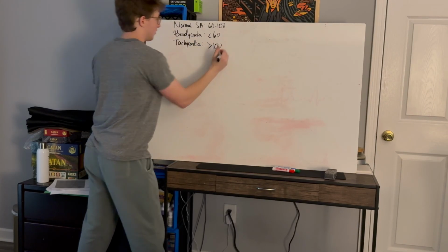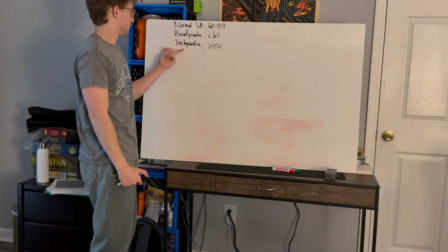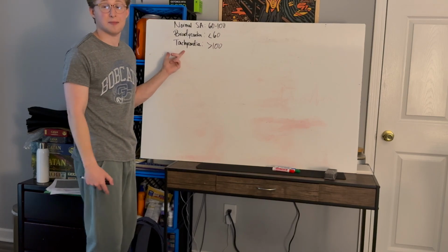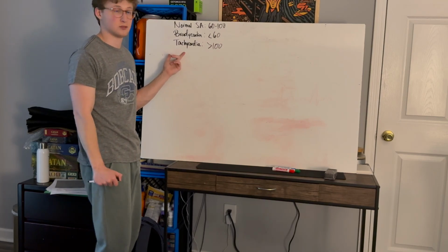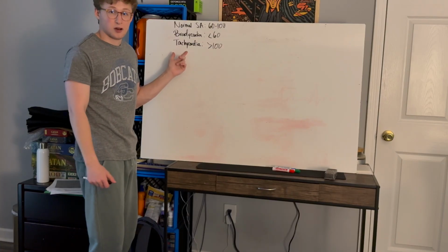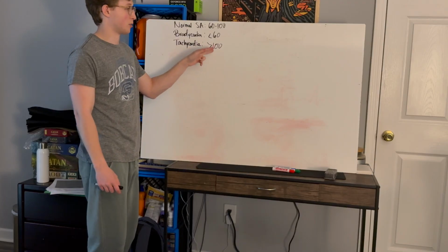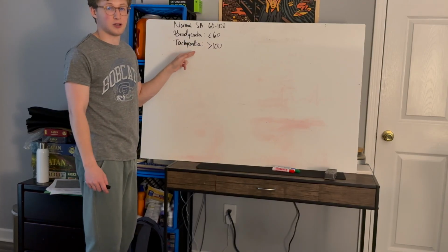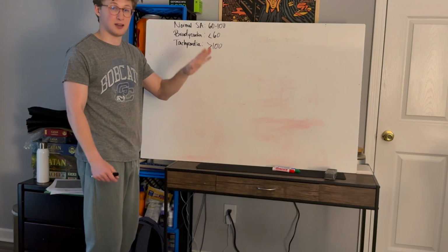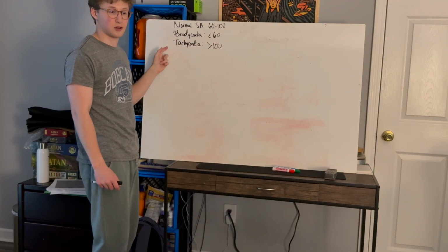Stressed, aroused, running, medications, hormones, nervousness, hypovolemia, a lot of reasons that we could be tachycardic, above 100 beats per minute. As long as that tachycardia is originating, we're talking about sinus heart rate, sinus bradycardia, sinus tachycardia.